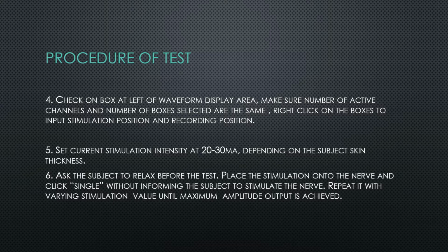And lastly, the data output for this test is the following. Latent period 1, onset latency value of the measured waveform, unit s. Latent period 2, complete latency value of the measured waveform, unit s. PP value, peak-to-peak amplitude of the measured waveform. Area value of the waveform, unit ms times mV.